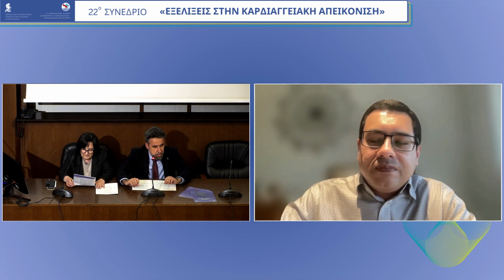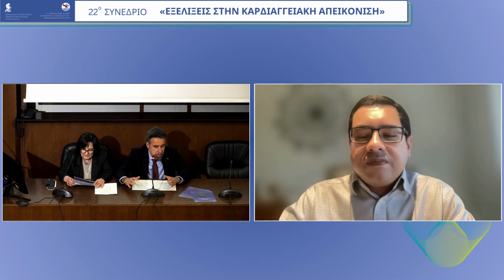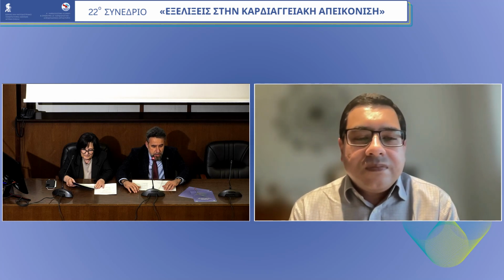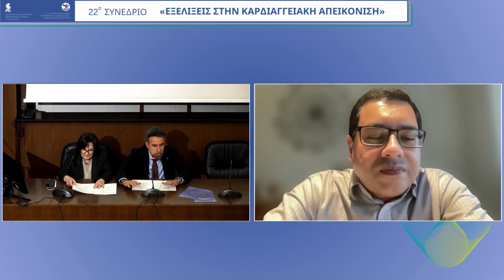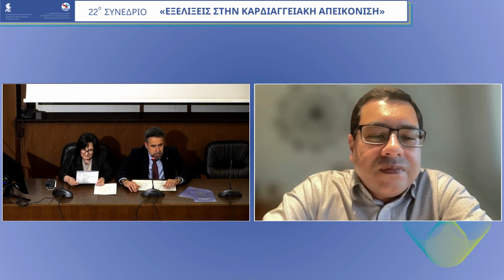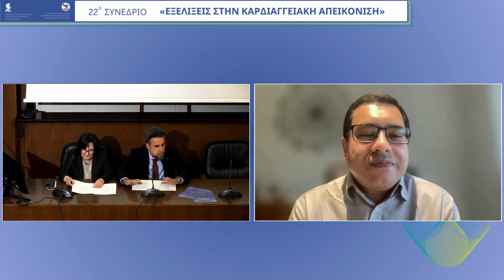I would like to point out here that this is a university hospital and a lot of young cardiologists are attending this talk, not only here, but through online connection. So from your perspective, what would be your advice based only on echo, excluding the CT, because I saw your slide on the differences between pannus and thrombus.